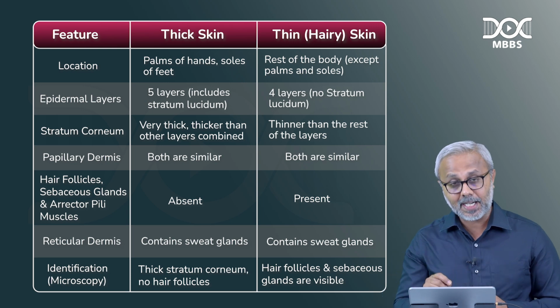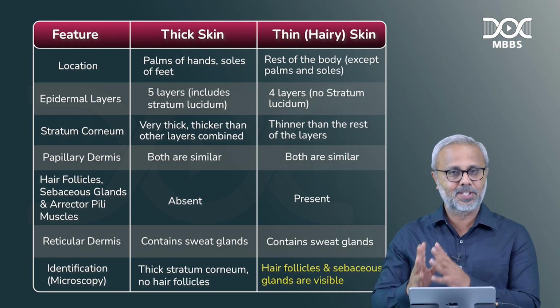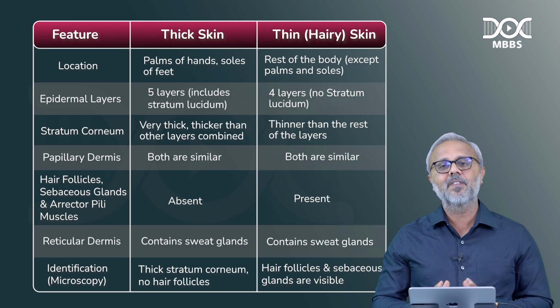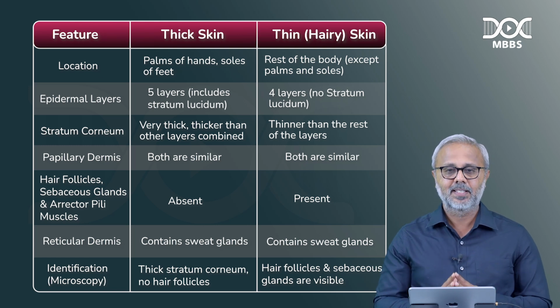But if you want to identify this in practical, presence of hair follicle and sebaceous glands, thin skin; absence of hair follicle, thick skin, right? And then comes the rest of the features. This is how you must identify, define and describe a slide of thick skin.